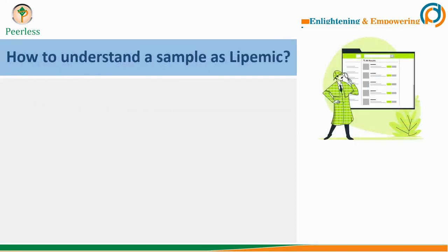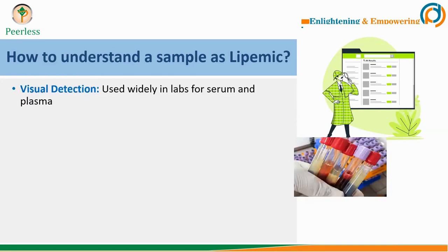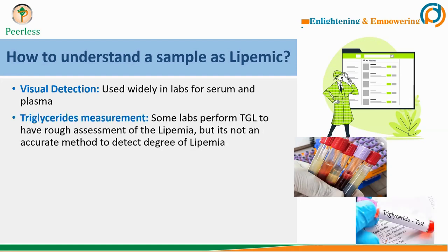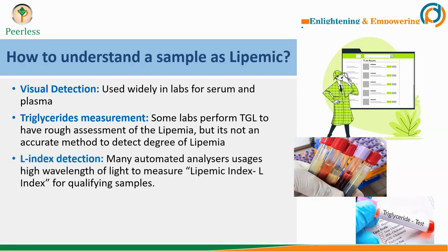It is important to understand how to determine if a sample is lipemic. The first and most common method is visual detection — you can see lipemic samples clearly in serum and plasma, and most labs use this method. Some labs perform a triglyceride test, and if the triglyceride value is above 400 mg/dL, they flag the sample as lipemic. A lipemic index can also be determined using high wavelength detection, and many large automated analyzers use this method to qualify samples.